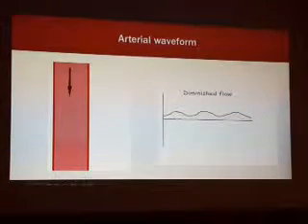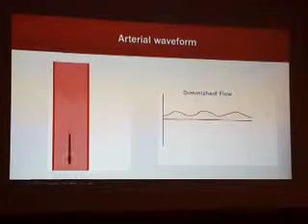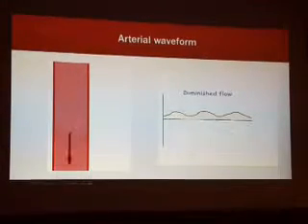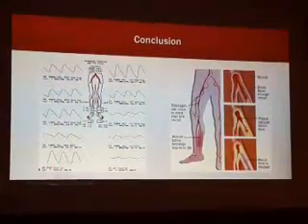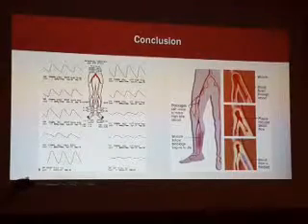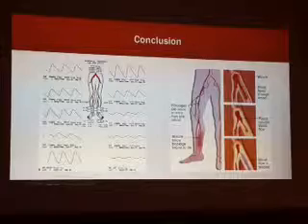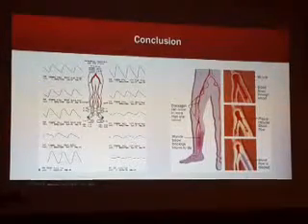We collect all this information and put it all in one document for a patient assessment. This is considered a screening arterial Doppler, or mapping. When any doctor requests it, he knows that we are doing a mapping for the lower extremity. Sometimes, if the patient has kidney failure, they go straight to ultrasound and do not need a CT angio, because CT angio can give you a scan, but if there is a contrast problem they go straight to ultrasound.